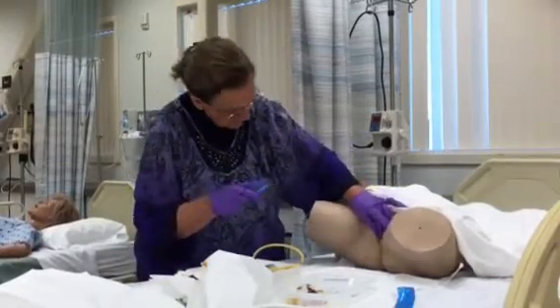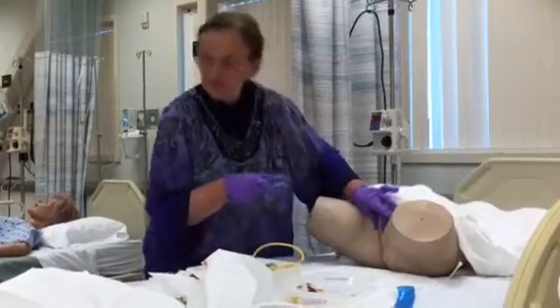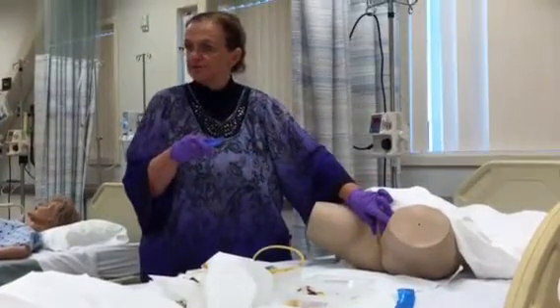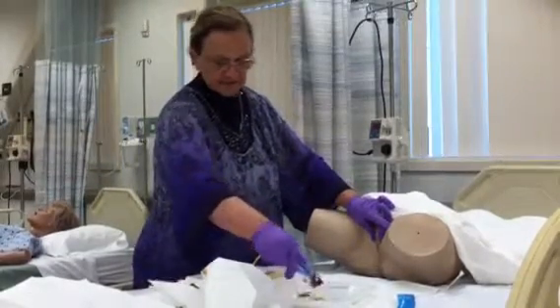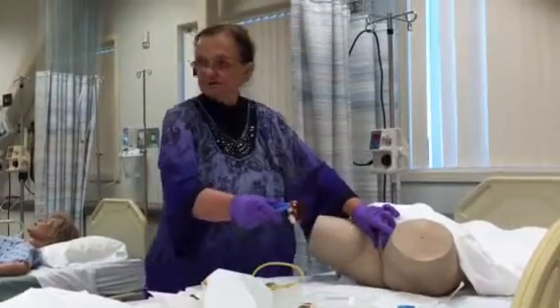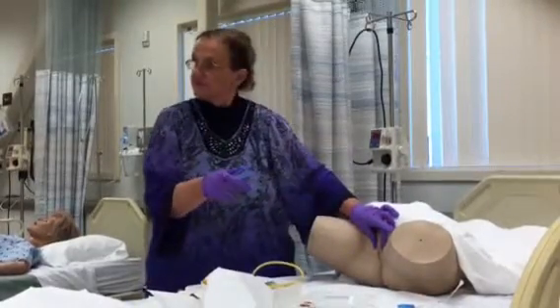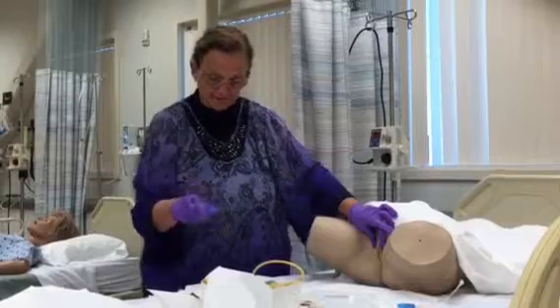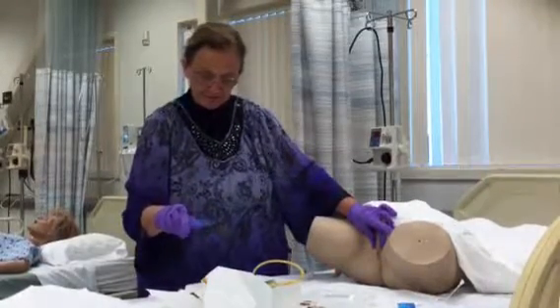And then the last thing I clean is the middle, and hopefully when you do that, that little urethra is going to wink at you. Now the mannequin, it's sitting there like a hole, so it's not hard to find, but I've got to tell you, urethras are difficult to find. They really are. And I'll tell you too why I like having a Plan B catheter.